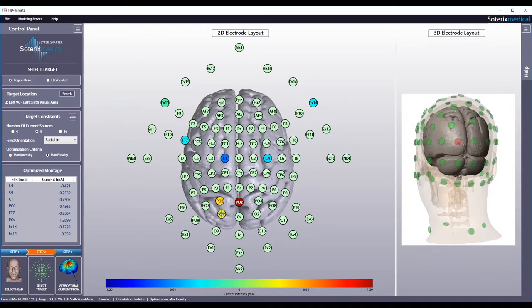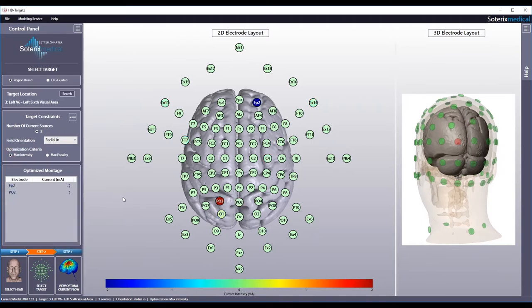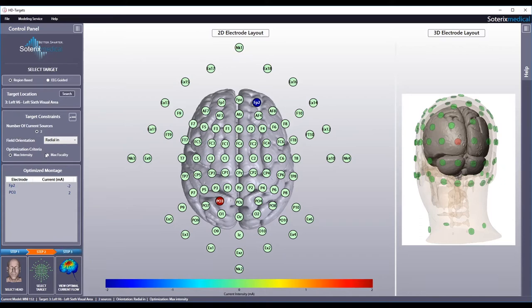Now let's say you are interested in maximum intensity prediction. Observe how HD targets will instantaneously update to provide the most optimal electrode montage. In this case, the prediction is bipolar with the anode at PO3 and cathode at FP2. Let's go back to maximum focality.